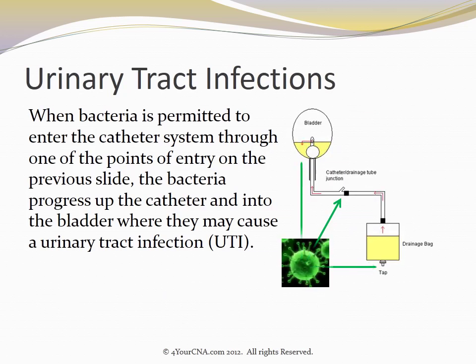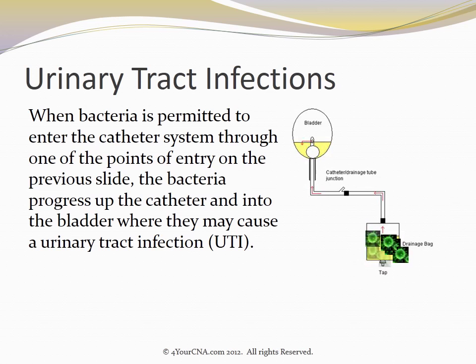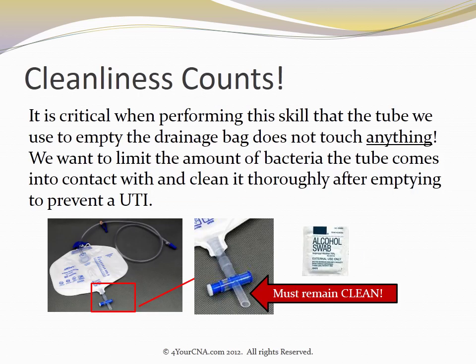When bacteria is permitted to enter the catheter system through one of the points of entry on the previous slide, the bacteria progress up the catheter and into the bladder, where they may cause a urinary tract infection, also known as a UTI. It is critical when performing this skill that the tube we use to empty the drainage bag does not touch anything. We want to limit the amount of bacteria the tube comes into contact with and clean it thoroughly after emptying it to prevent a UTI.